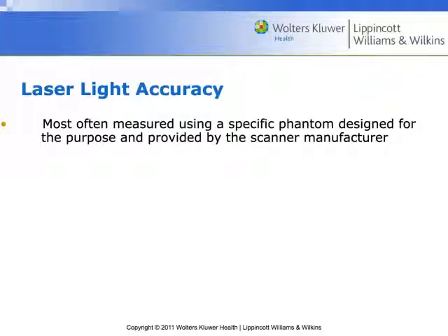Laser light accuracy, as I mentioned, we're going to do tests every day to make sure that the laser lights are lining up appropriately.